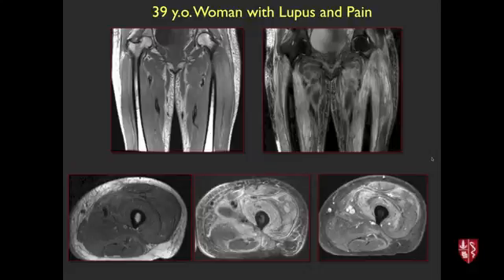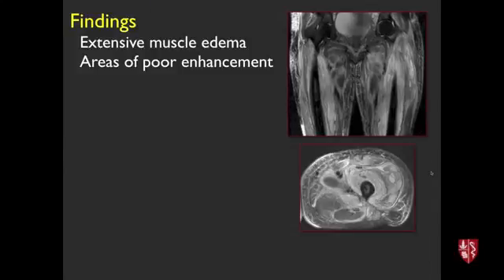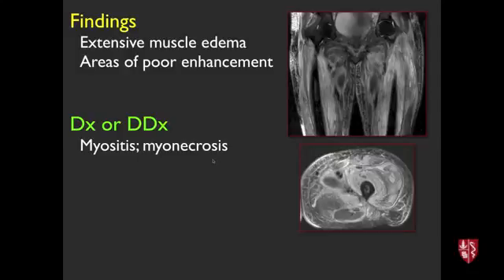Next case, 39-year-old woman with history of lupus and bilateral thigh pain. MRI shows extensive edema involving bilateral thigh muscles — quadriceps and somewhat posterior musculature. Some areas on contrast did not enhance well, suggesting possible myonecrosis. This diffuse process represents extensive myositis, likely related to her vasculitis. Non-specific myositis, inflammatory change, or dermatomyositis could look similar. It's hard to detect gas on MRI; if soft tissue gas were present, CT would be better for detecting necrotizing fasciitis.